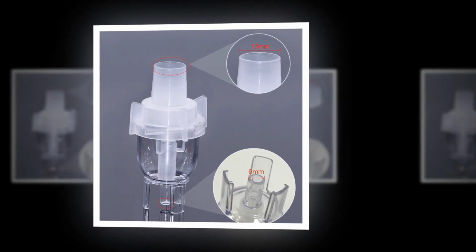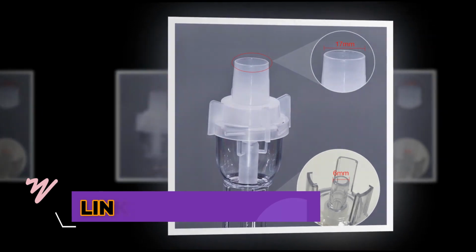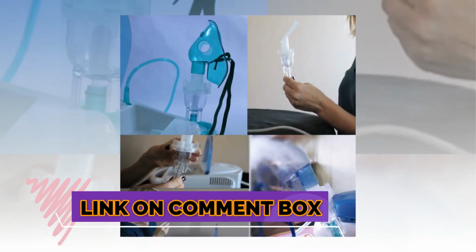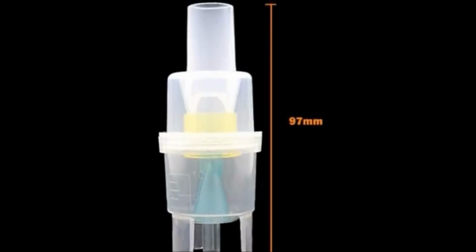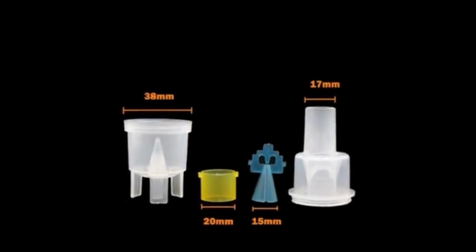You typically need a nebulizer prescription from a healthcare provider, but most insurance plans cover it. Even if you can purchase the machine over the counter, you will need a prescription for the medications. Nebulizers are relatively easy to use. You take the medication by simply breathing normally through the mouthpiece or mask.